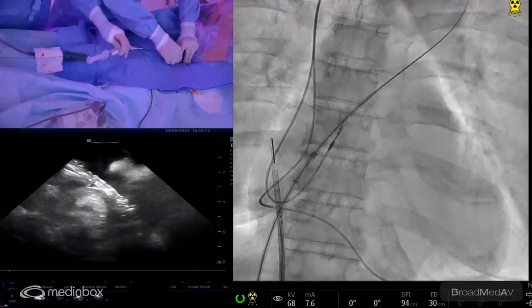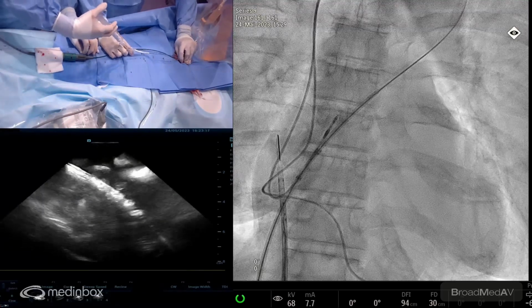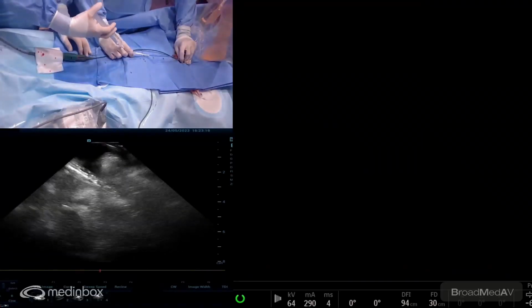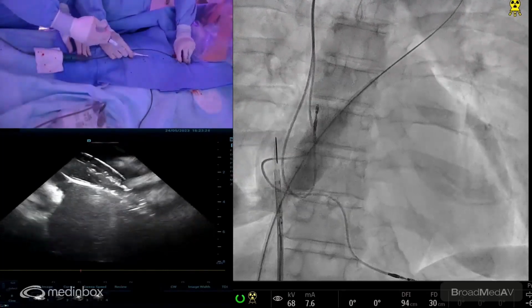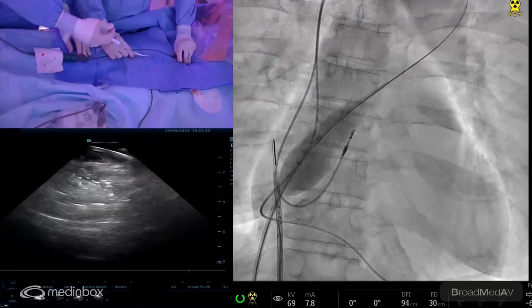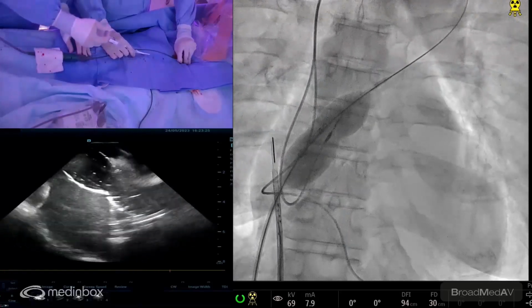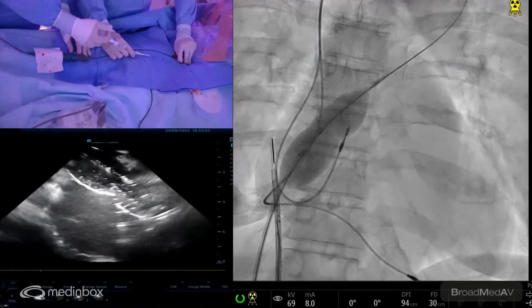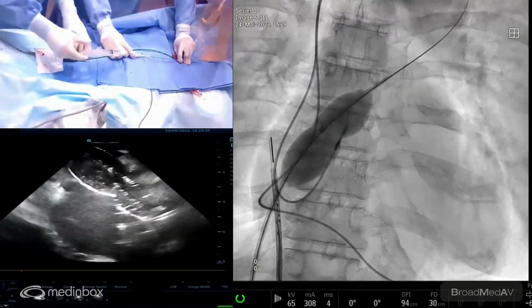As I said, two markers separated by 15 millimeters, but also two more proximal markers separated by 2 millimeters. If the two proximal markers are separate, it means that you're well aligned with the defect. I'm starting to inflate within the defect, adjusting to make the most central part of the balloon where the defect is. Something like that. It does look large.